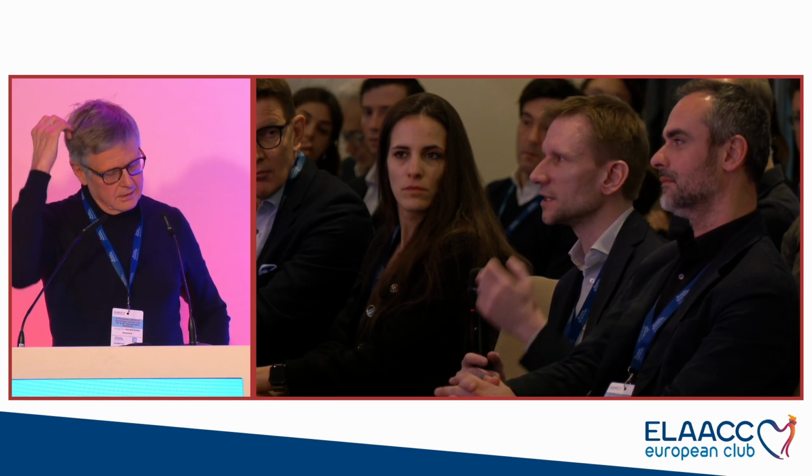Ole: Yes, Sergio and Jens-Erik, having a little experience with the conformal device, or the ACUFORM, or however you call it now, indeed, the device itself is extremely soft. There's no big robust skeleton like we're used to from a Watchman FLX or an Amulet. And you have that tether, you don't have a cable, which makes you totally dependent, and it's a strange feeling as an operator in the beginning, I have to say, that you're totally dependent on your sheath. Your sheath determines everything. Because the device is so soft, it just hangs on a tether.